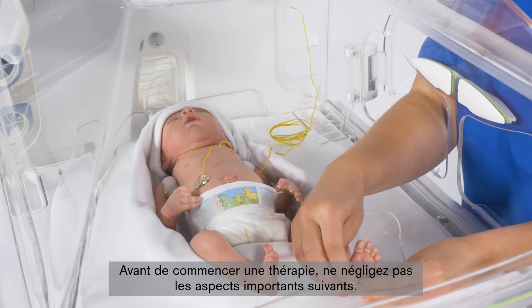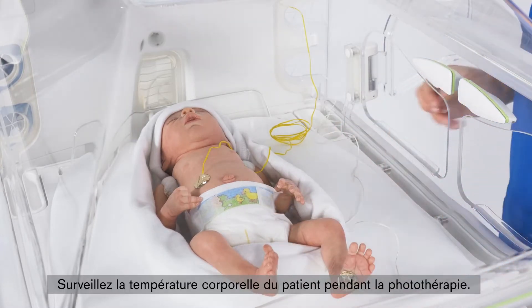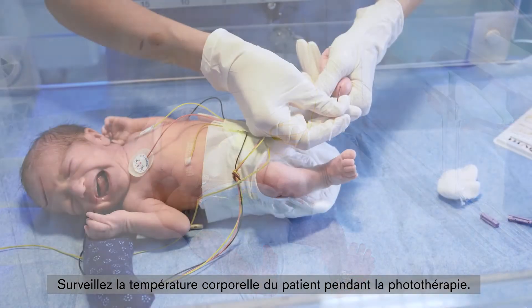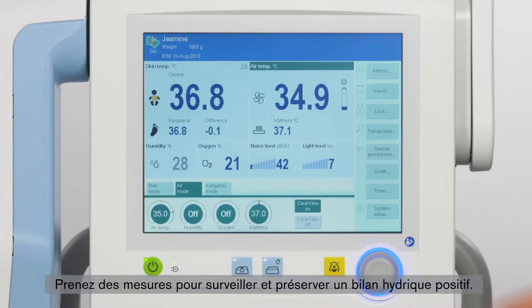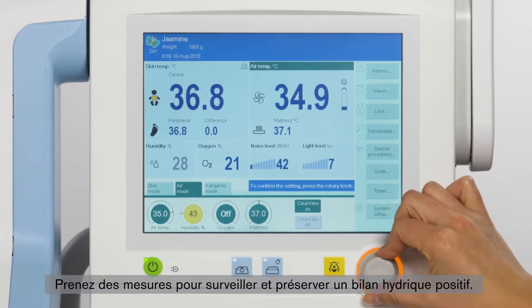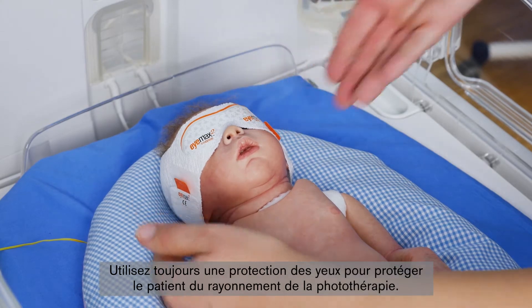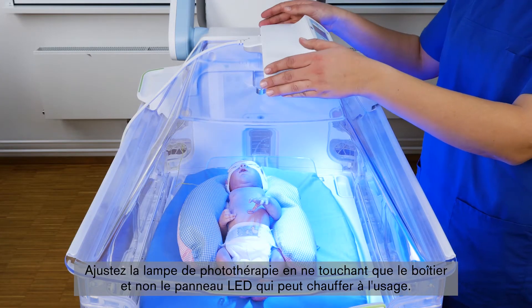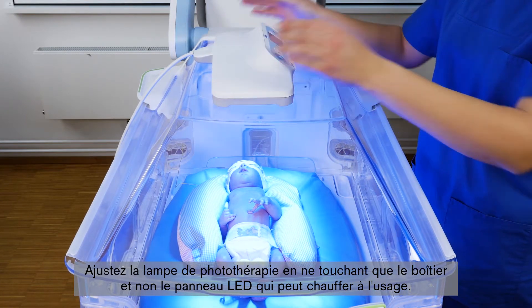Before you start a therapy, consider the following important aspects: monitor the patient's body temperature during phototherapy; measure patient bilirubin levels regularly; take steps to monitor and maintain positive water balance in the patient; always use eye shields to protect the patient from phototherapy equipment radiation. Adjust the phototherapy light only by touching the housing and do not touch the LED panel, since it may become warm during use.